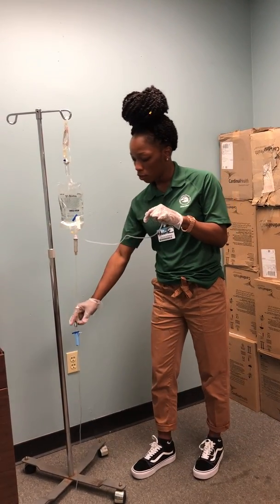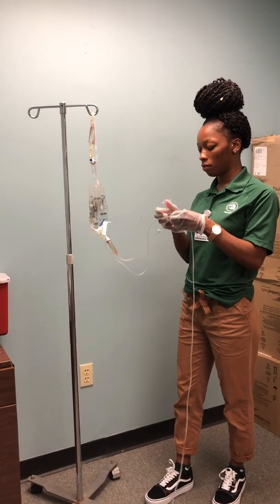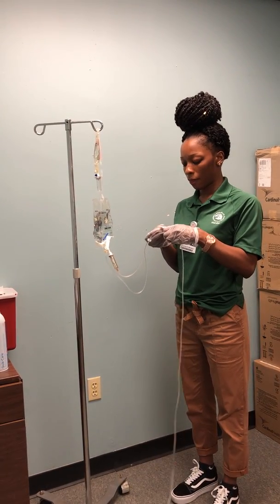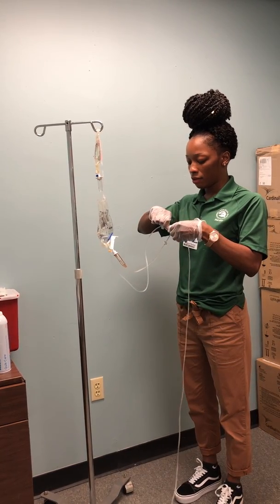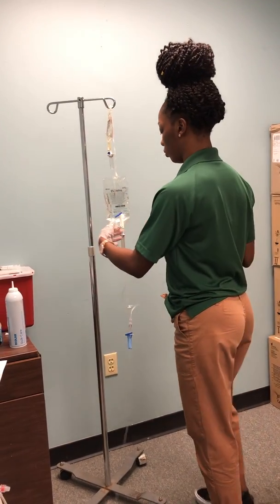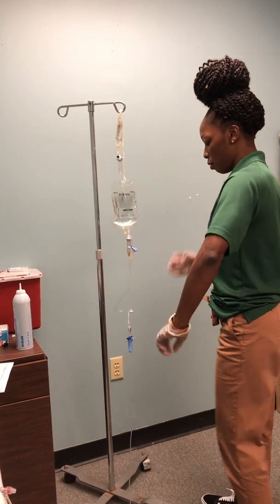I would clean the port closest to the primary bag. And then attaching my piggyback. Unclamp my piggyback and regulate my drops using my primary clamp.